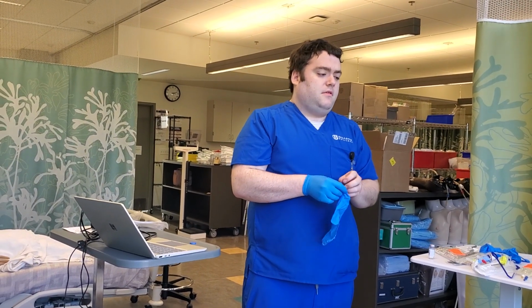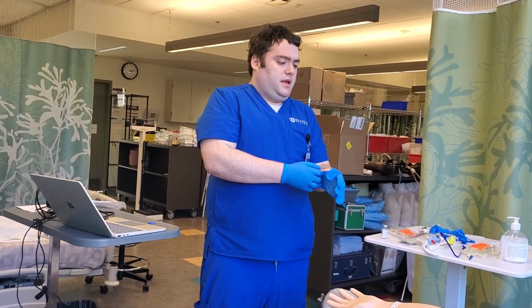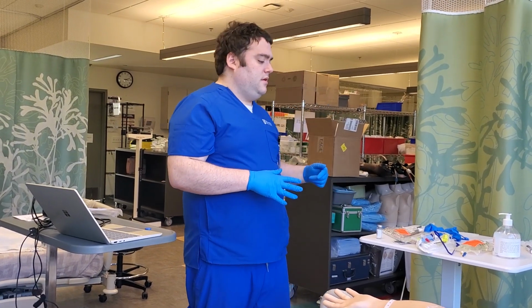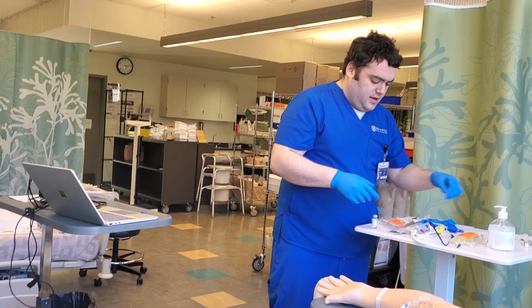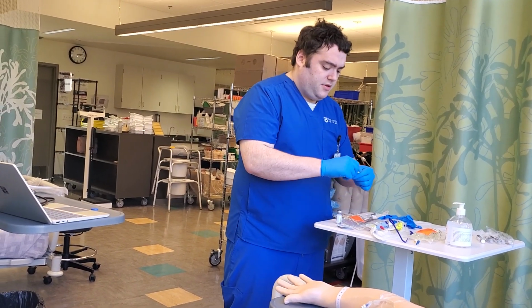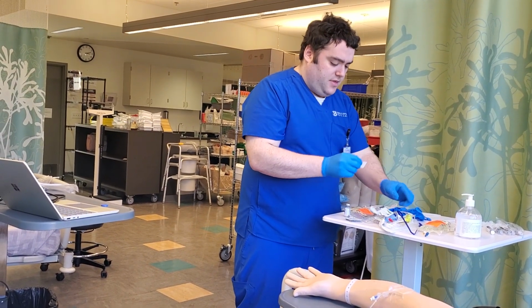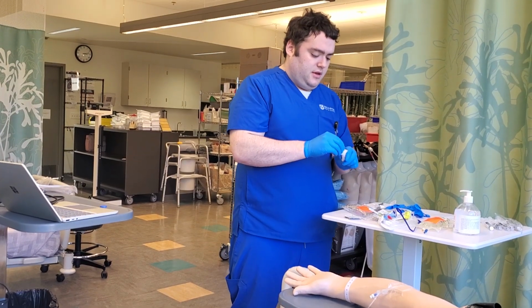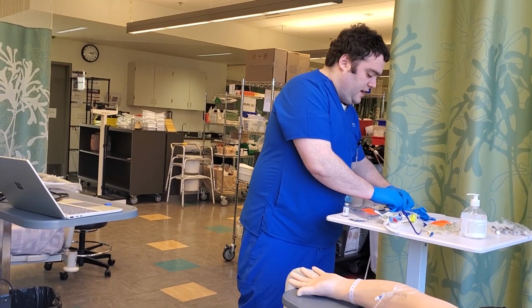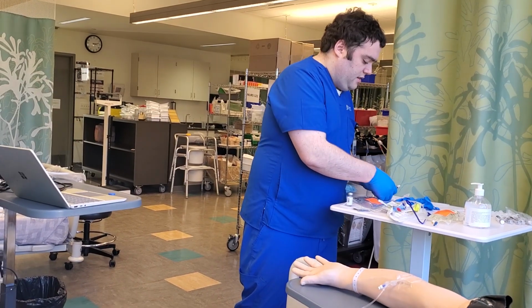We're doing the 5 rights: right medication, right patient, right dose, right route, right time, and expiration dates, of course. We're going to scrub the medication vial and get this set up.